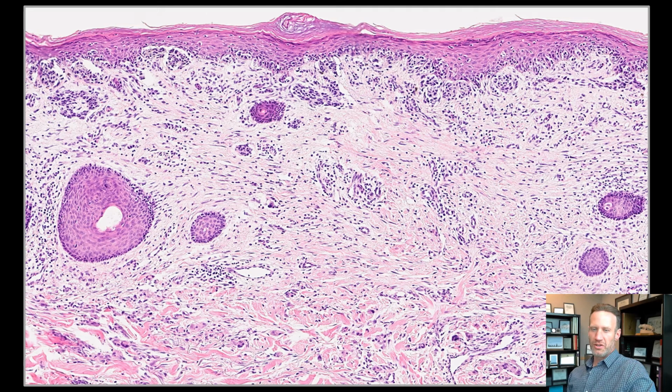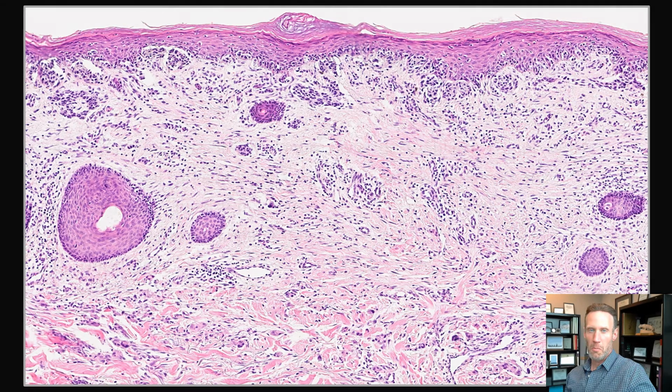Now, most of us were taught that oftentimes the most effective first step in evaluating any previously biopsied melanocytic neoplasm is simply to obtain and examine the initial biopsy. In many cases, that's all that's needed. But in this case, for reasons that still aren't entirely clear, neither the prior biopsy nor the report was made available to the referring institution. That's an unusual situation, fortunately, but it's something that can occur from time to time in my experience, and it forces us to rely on other means of establishing diagnosis.